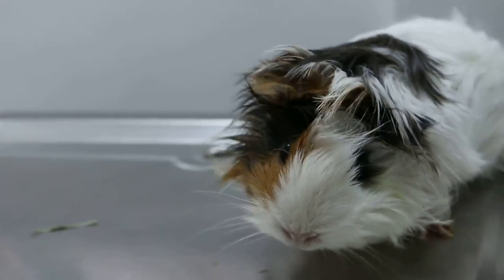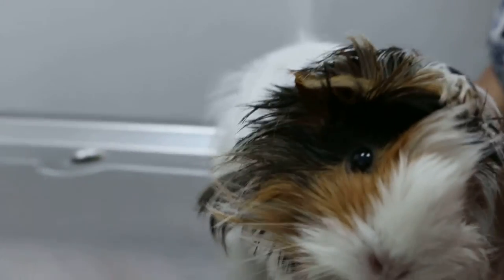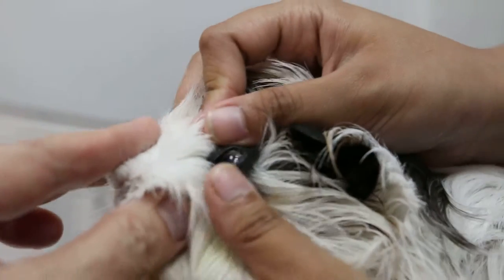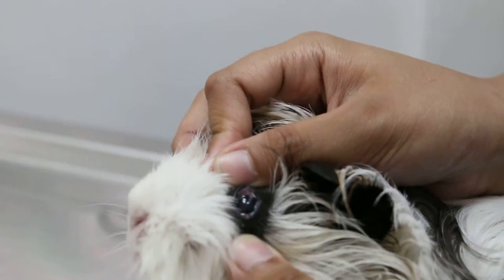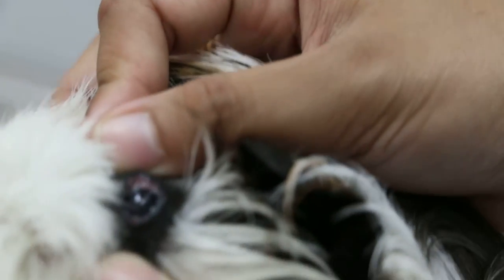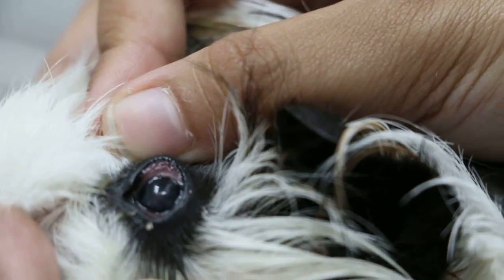Hold him to the left side so that I can focus on that. Is it tilting very badly? Okay, tilt yeah. See the eyes? Come, upper and lower eyelid open up. Still red? See red? Let me zoom in first. Up some more — can open some more. So he's still rubbing his eyes.